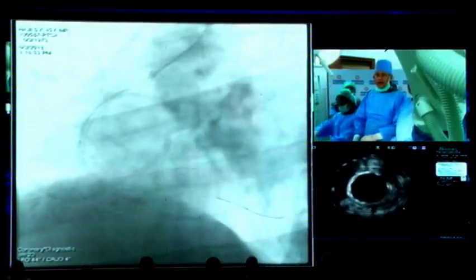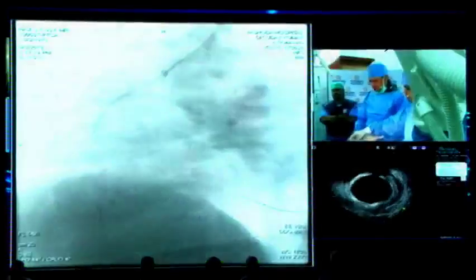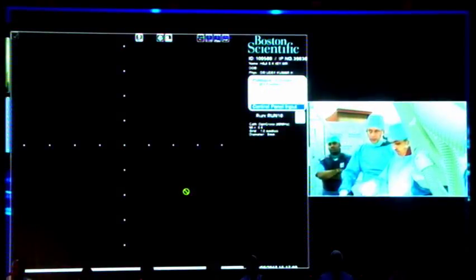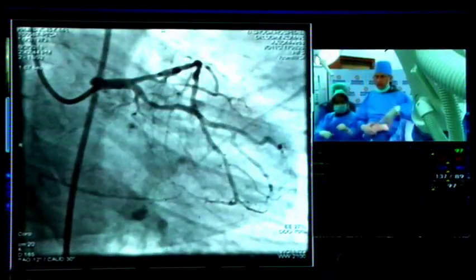Can you hear us? Yes. Dr. Mam, I think you're live. Okay, so we're almost finished. Can we have it from the beginning, please? Stop here. Stop the IVUS run. Can we have the angio again, please? Just move the IVUS. I'll take it off. I think you were trying to do an IVUS when we left you. Yes. Okay.